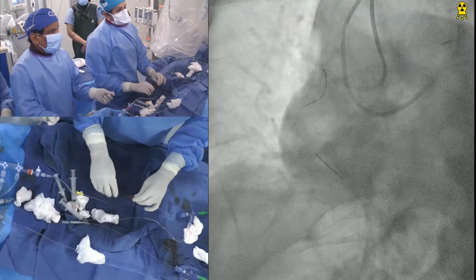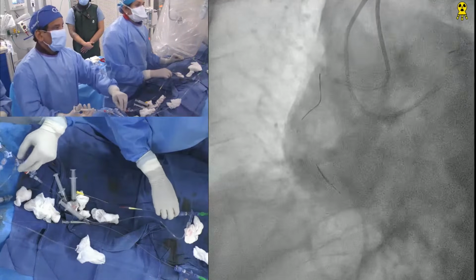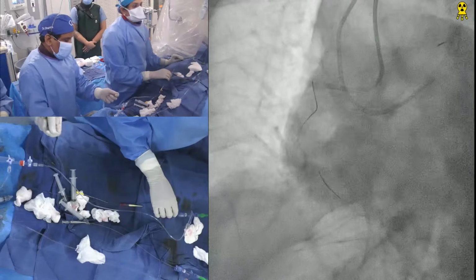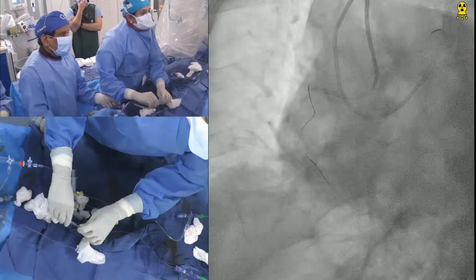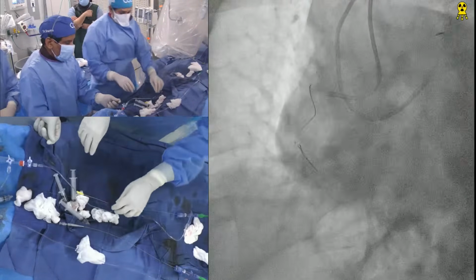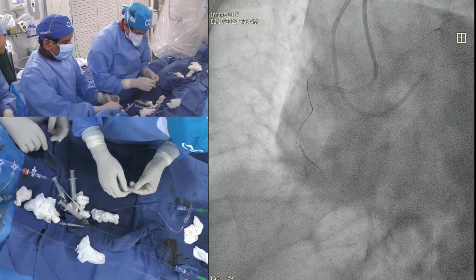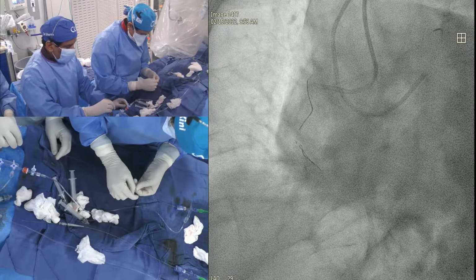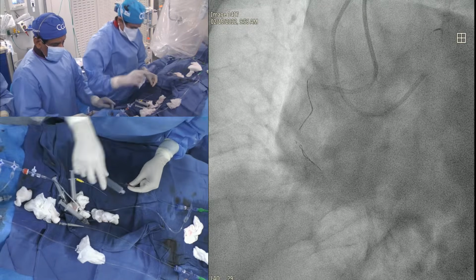Yeah, you had to bring your microcatheter further because Gaia will not make the turn. Antegrade. I think the guide is coming out. Everything is against us now. Good. One second. Don't touch it.